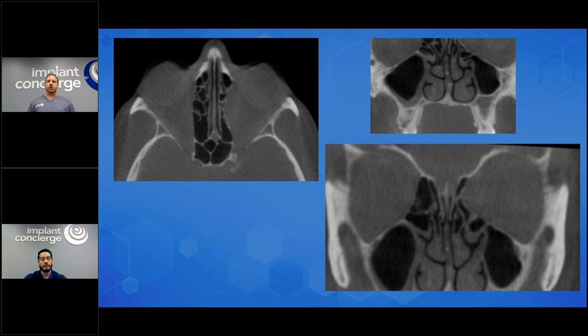But no, Hounsfield units, you're going to see some software that's going to allow you to play with the Hounsfield, but it's just like an algorithm to manipulate the contrast and brightness. Of course, you can manipulate those really well to see bone better, but you're never really going to see much soft tissue. All the soft tissue is that soft tissue density. That's why in this image you can't tell if there is a tumor in there. And if there is, it's a soft tissue density. But the manipulation of Hounsfield units doesn't work with cone beam CT.